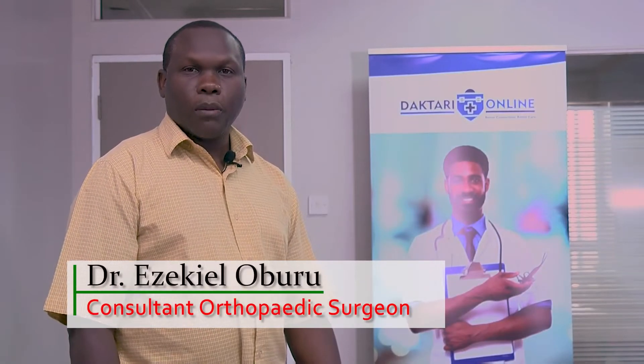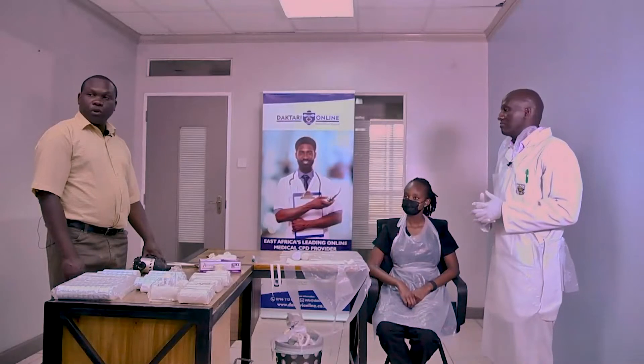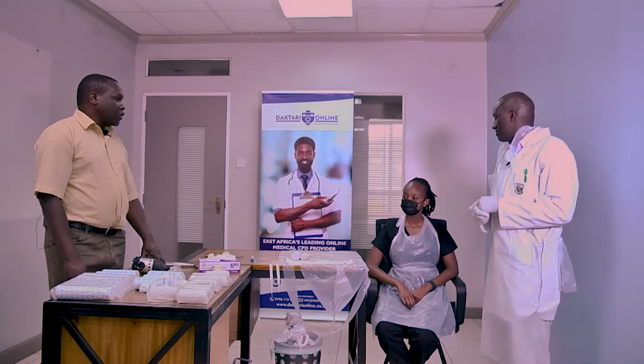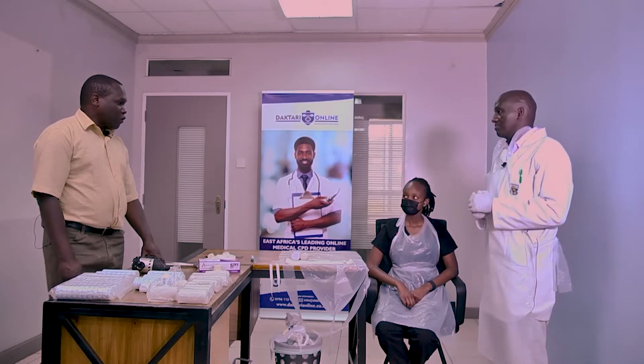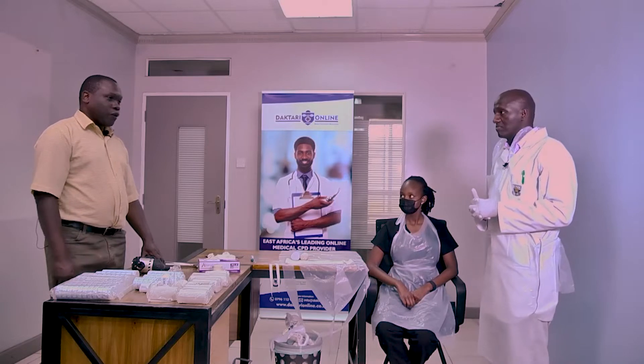Hello, my name is Ezekiel Oburu. I'm an orthopedic surgeon at the University of Nairobi and today we are putting a series of casts. We will now proceed to put a radial gutter splint. With me here is Zakaria Kimengich, a very experienced orthopedic trauma technologist, and we have our patient Cynthia who has agreed for us to use her hand for demonstration purposes. Over to you, Zak.